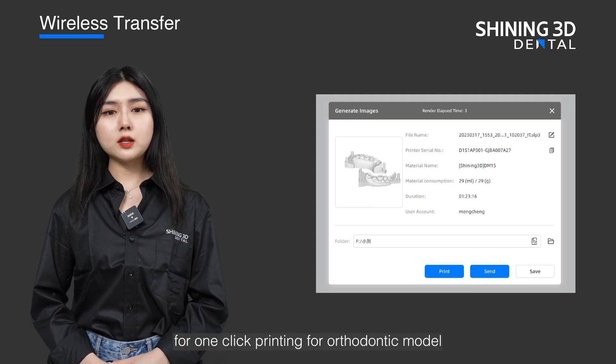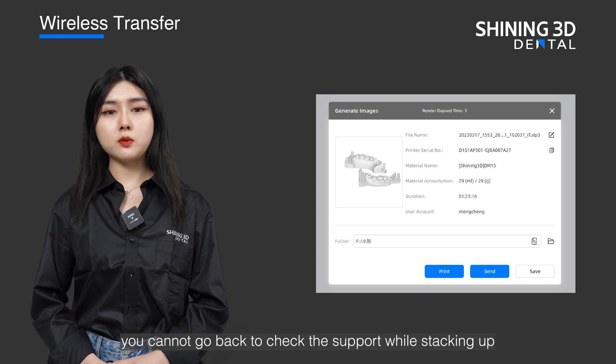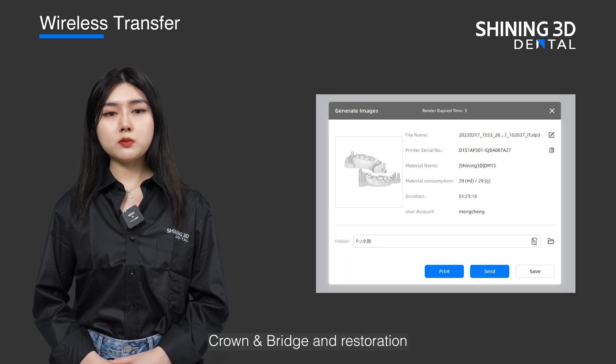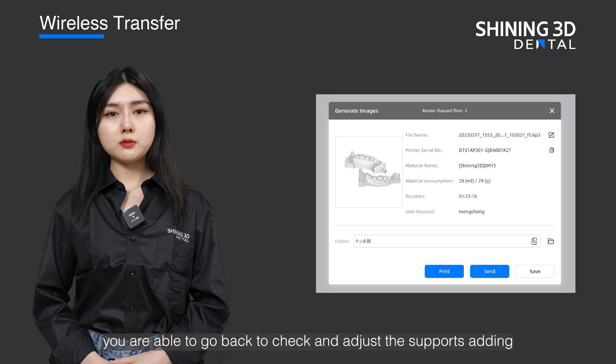Unfortunately, for one-click printing for orthodontic models, you cannot go back to check the support while stacking up, as all the supports are made by algorithm. But for models, crown and bridge, and restoration, you are able to go back to check and adjust the support settings.